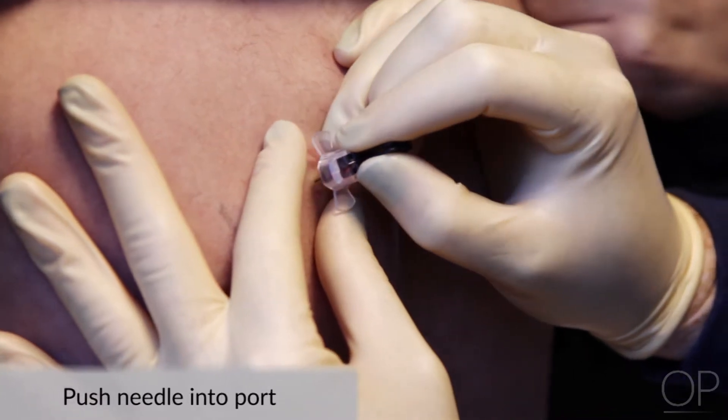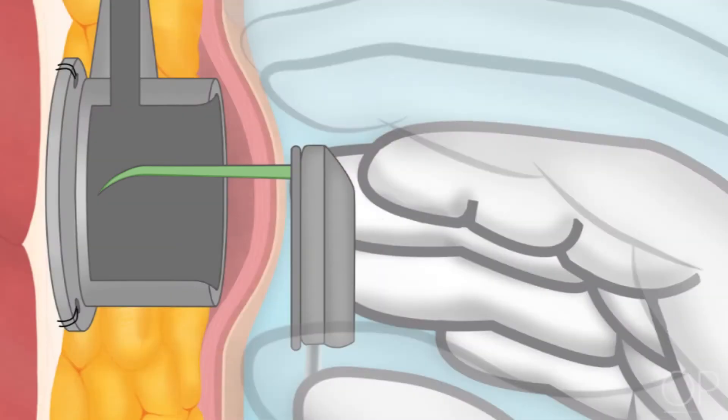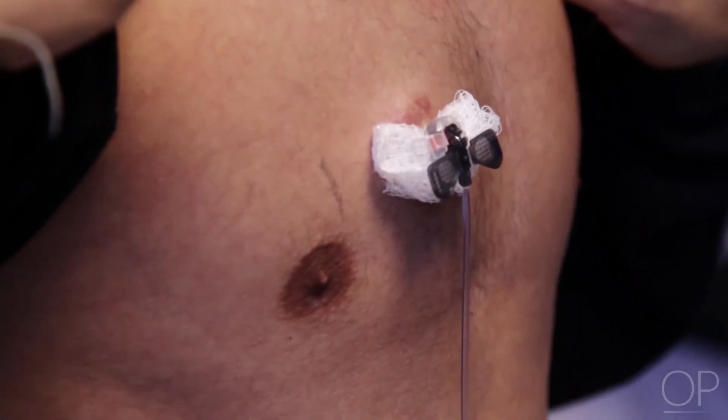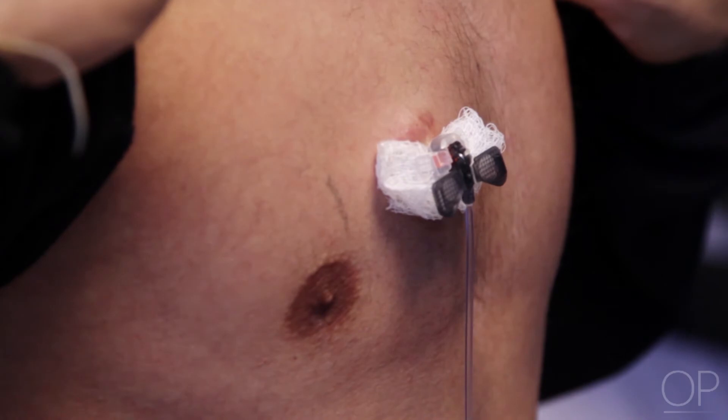With your dominant hand, firmly push the needle perpendicularly through the skin into the device until the needle meets the bottom of the device. It is important that there be a small space between the needle and the skin line. If flush with the skin, the needle length is too short and there is an increased risk of infiltration. If necessary, support the space between the needle and the skin with a folded 2x2 gauze to prevent rocking of the needle, which can cause damage to the septum and irritate the skin.